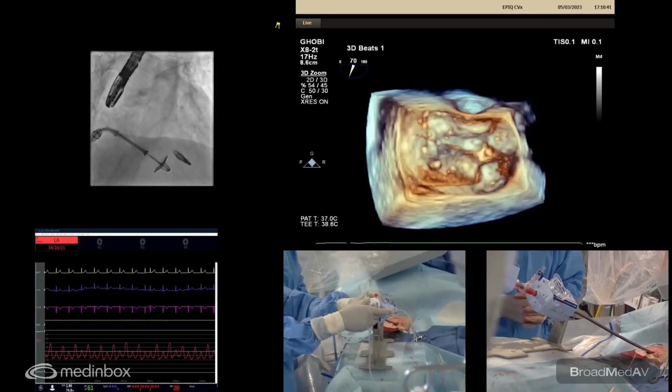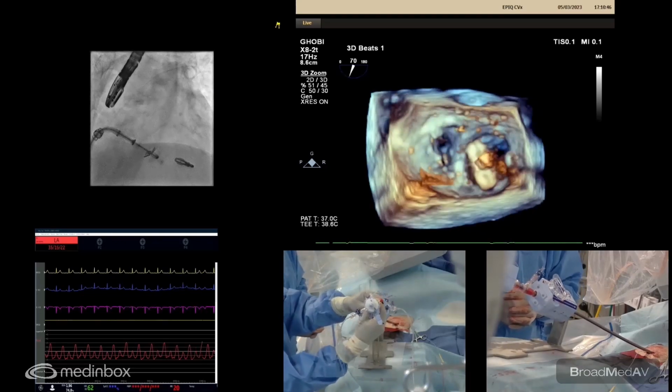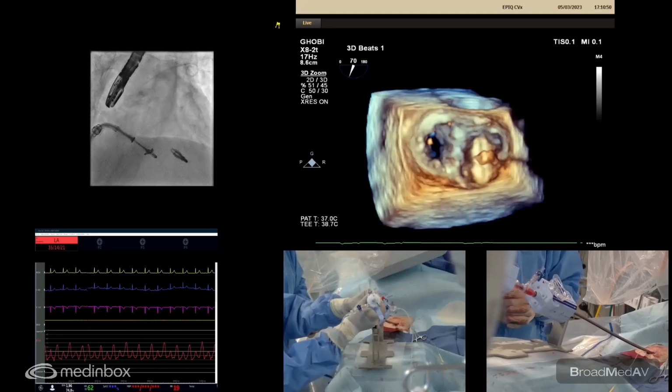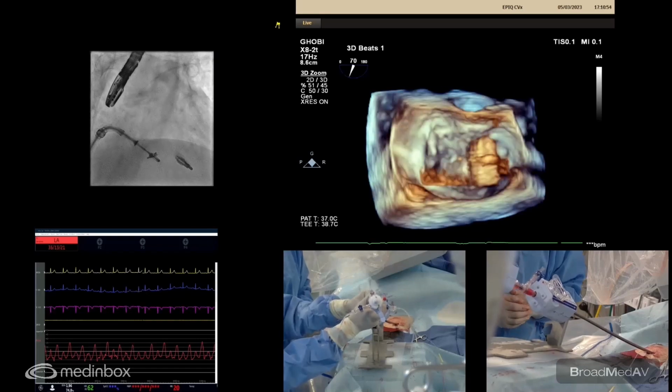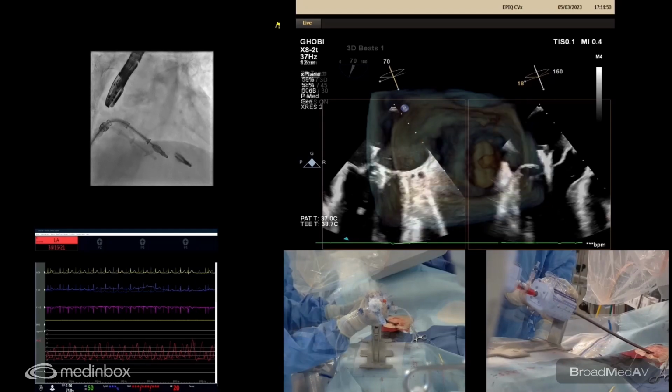Oh, not bad. Pretty bad. It's close. Orientation perfect. Wow. So just going to come back. We joke it seems to come out 90 degrees every time. Yeah, that looks great. So great. We're orienting the clip by just transmitting the torque to straighten it out.